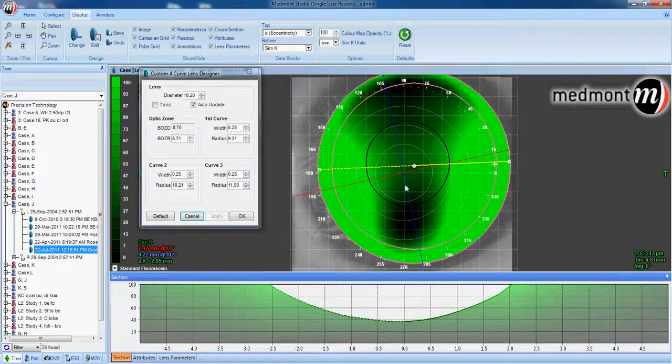With our bearing at 12 and 6 o'clock, the lens will not want to have a superior positioned lid attached type alignment with good movement with the blink, good tear pump. You would have movement along the horizontal meridian, possibly a positioning of the lens significantly nasal or temporal. So you can determine which contact lens parameter would be ideal for this eye.